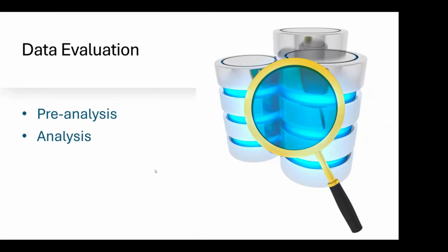So next couple of steps, you have your pre-analysis and your analysis. So the pre-analysis, you can use doing queries of the systems. It's advisable to assess the state of the data, at least at a high level. Consider all the data from the first exam stored, or at least the one that's in scope, including any exams stored prior to or without DICOM modality worklists. So in other words, if you have a whole bunch of exams that were manually entered, trying to understand that. Looking at outside exam importing and identifier localization procedures.